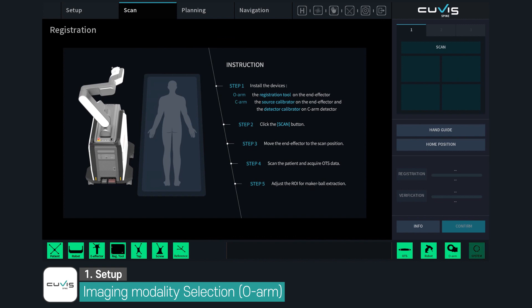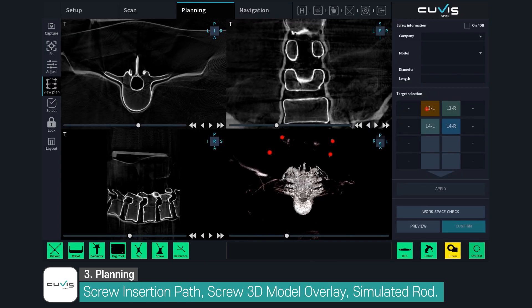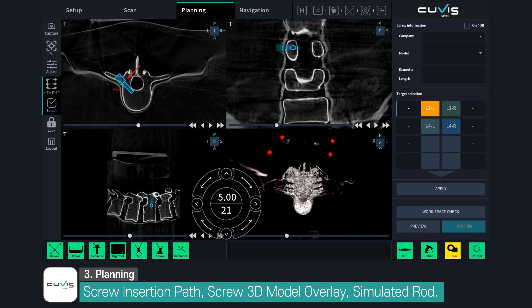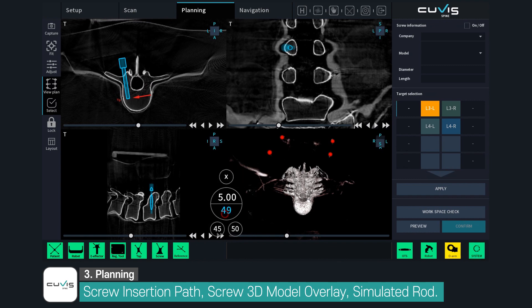QVIS Spine can also be used with O-Arm as an intraoperative three-dimensional imaging device. In this case, the user can operate the system more intuitively during the surgical planning and navigation steps.